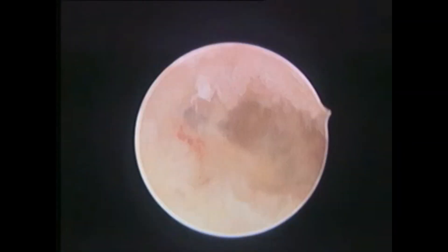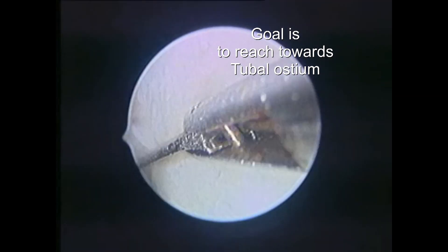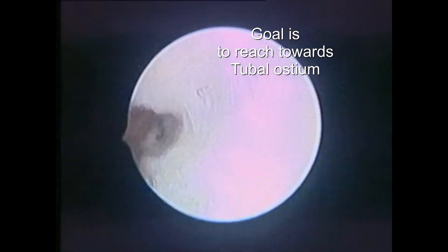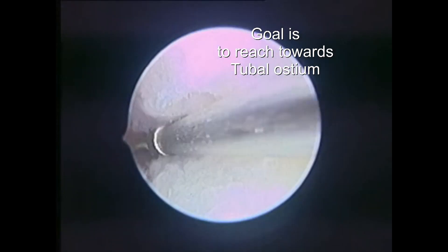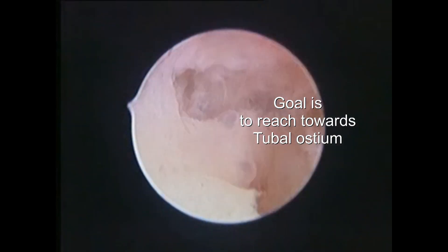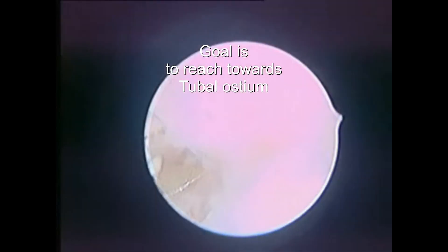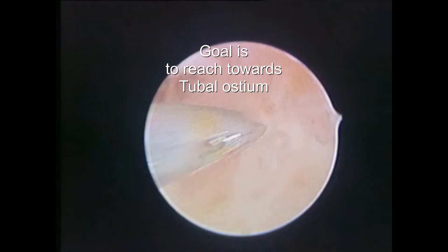The cavity opens up because fluid pressure also helps to open it — that is the principle of hysteroscopic adhesiolysis. The advantage is that it's not only the scissors but the fluid also works in removing flimsy adhesions. Continue cutting, remaining perpendicular to the lateral wall. Your goal should be to see the ostia — withdraw your scope near the internal ostia, see that a triangular cavity has been formed, and then continue doing adhesiolysis near the fundus.